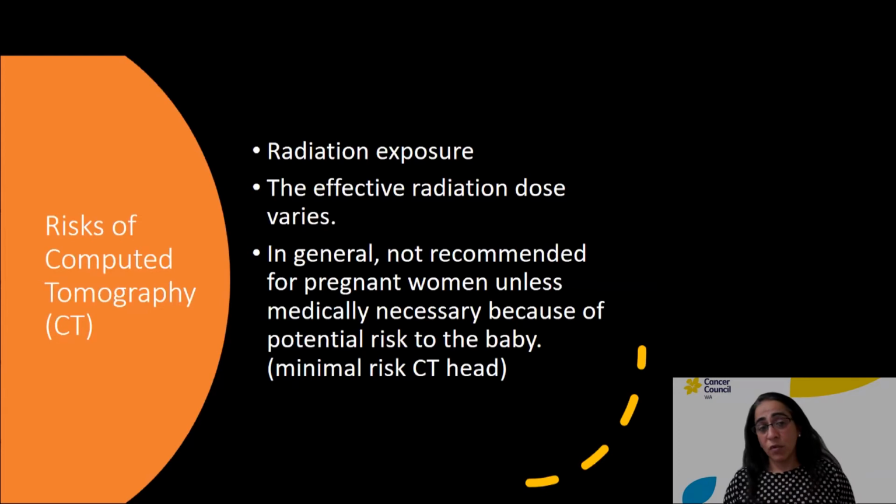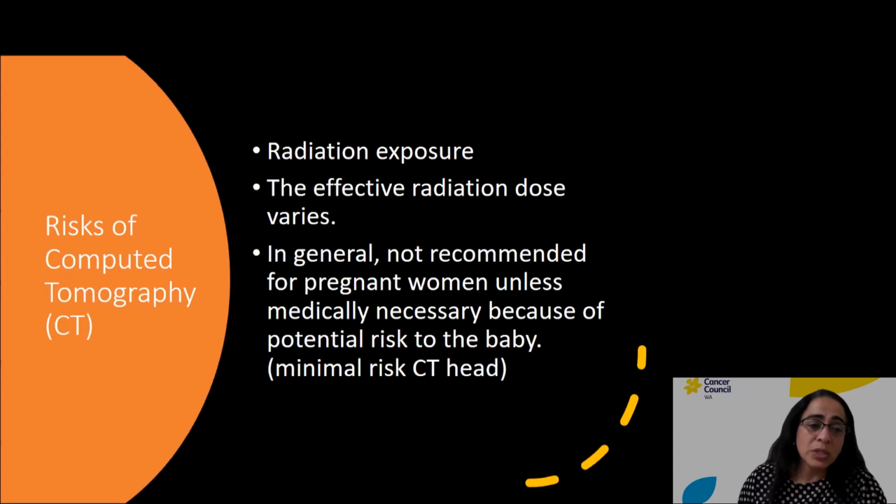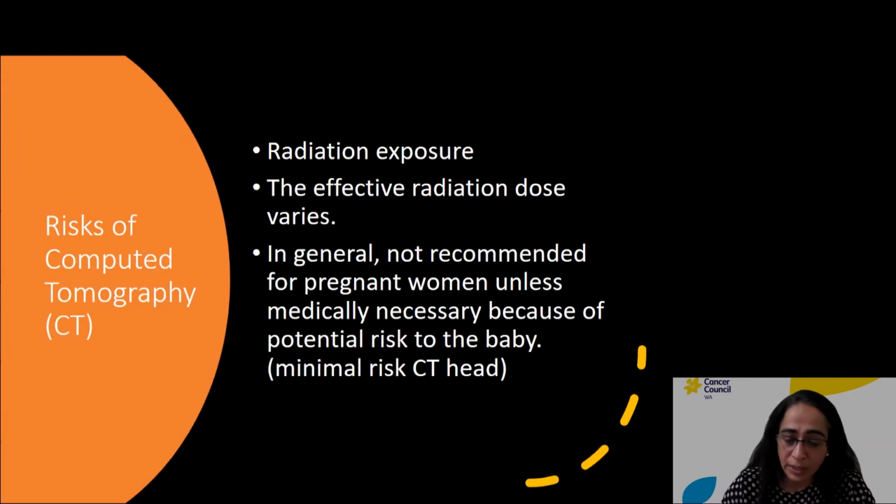However, a CT does involve radiation exposure, and there's always a slight risk associated with any exposure to radiation. However, the benefit of an accurate diagnosis will generally outweigh the risk, and the effective radiation dose involved in CT varies with the type of CT study being performed and what organ. In general, we do not recommend CT in pregnant women unless medically necessary because of potential risk to the baby. However, this risk is minimal in patients undergoing CT head.